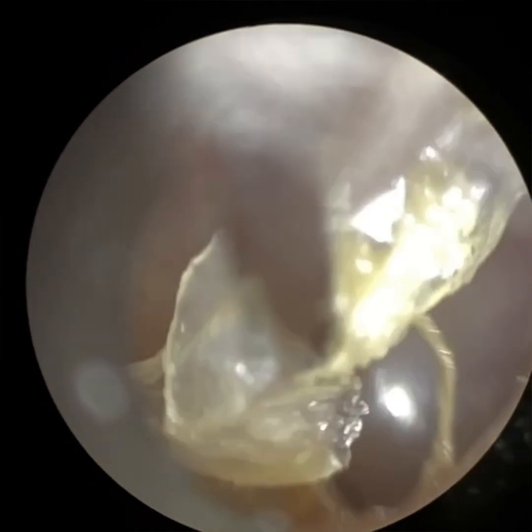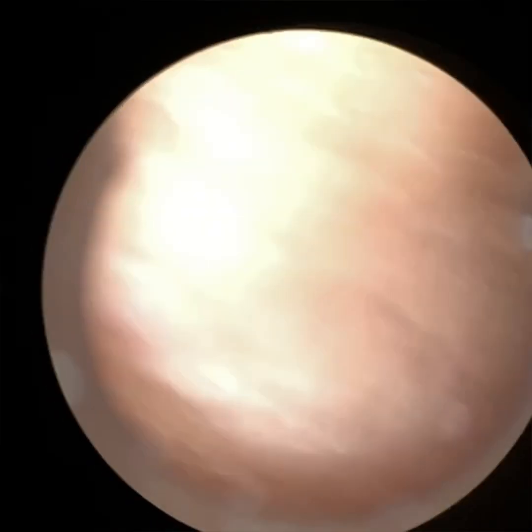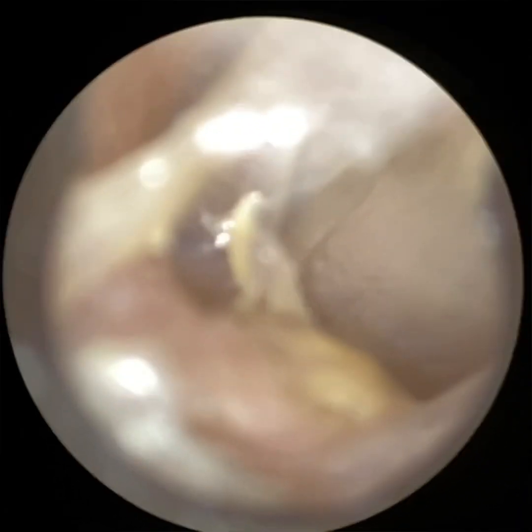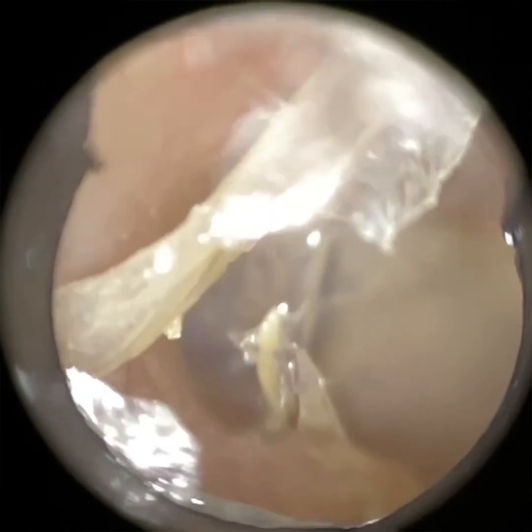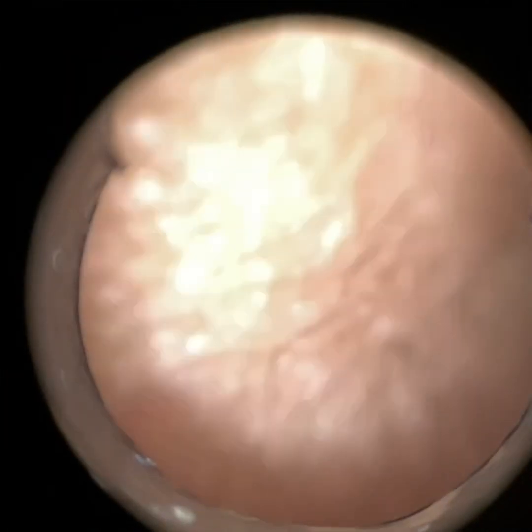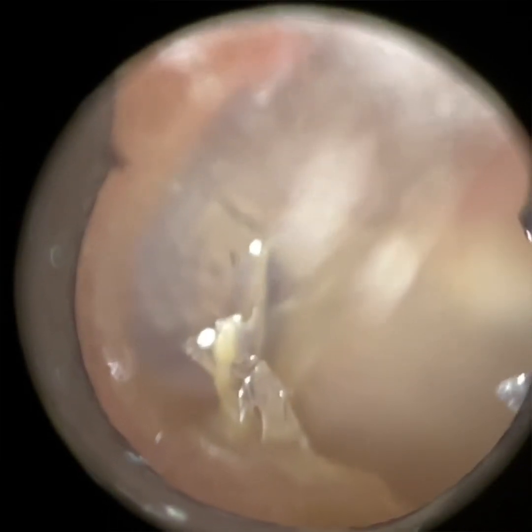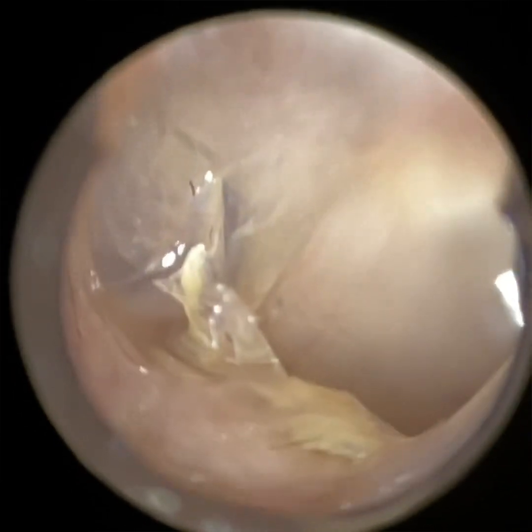The view that you're seeing is very similar to an ENT operating microscope. The difference with an ENT operating microscope is that you get depth perception via binocular vision. With the WAXscope, because you're viewing it on a 2D screen, your depth perception is by focus. There's a misconception that you can't obtain depth perception via 2D vision. That's not necessarily correct. I use the endoscope all the time, and that's a 2D view, and I feel like I've got very adequate depth perception. You just acquire it in a different way.